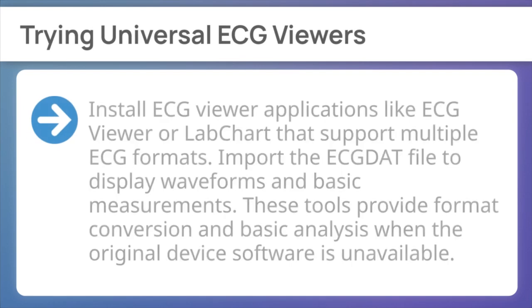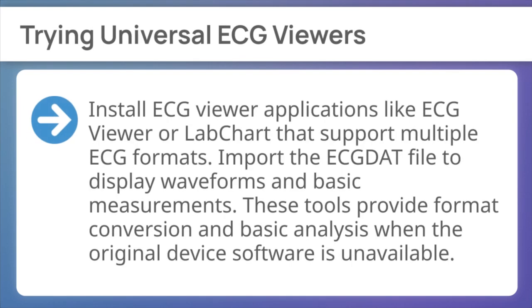Next, trying universal ECG viewers. Install ECG viewer applications like ECG Viewer or LabChart that support multiple ECG formats. Import the ECGDAT file to display waveforms and basic measurements. These tools provide format conversion and basic analysis when the original device software is unavailable.